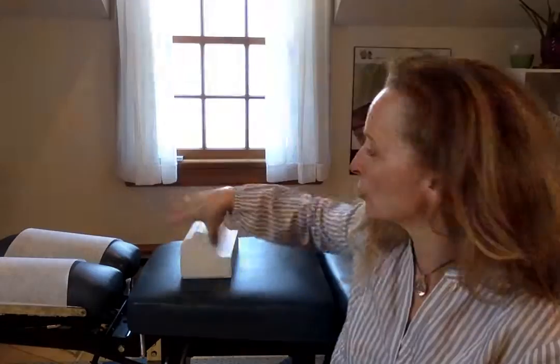So you're going to start off by just lying on it for as long as you possibly can. It's uncomfortable. It's a really, really dense foam. So if I started you on the pool noodle, you're going to feel this is a lot different than the pool noodle, but the pool noodle was just to kind of prime you to get to this. It can be really uncomfortable. So if you're feeling like it's uncomfortable, that's normal.